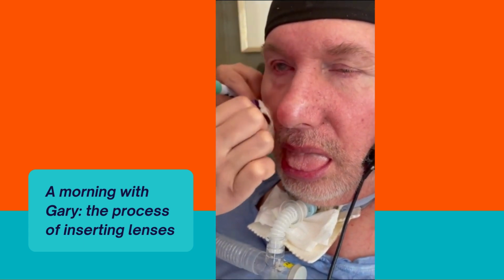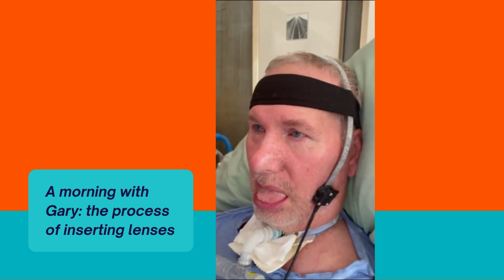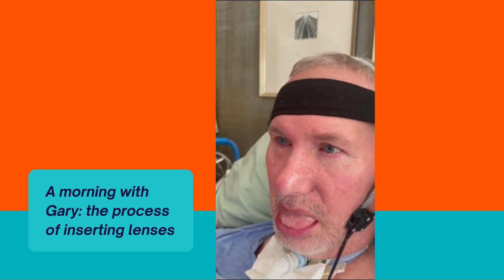Awesome. Give him a second to adjust, and then I'm going to check to make sure I don't have a bubble. She'll check, and then she's going to lean it back. The poor dude's been sitting straight up for a while.